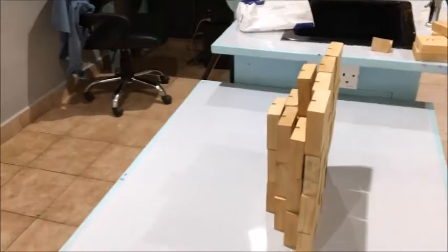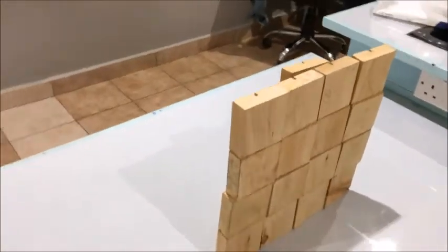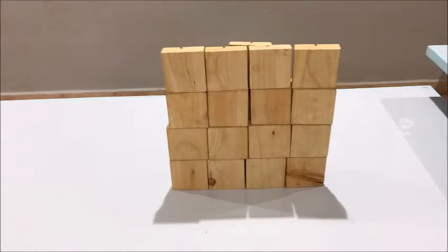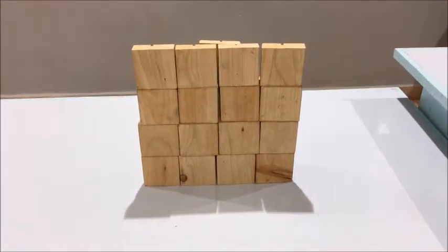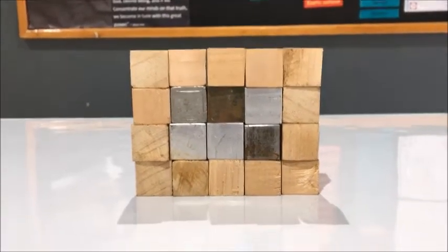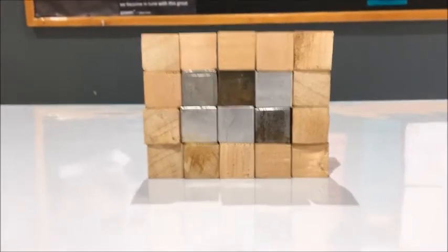And it's not just about shape, it's also about densities and things like that, and absorption, just the way that it always was before. So to model that a little bit more, I'm going to make up another set of voxels now. So I want you to imagine now that we are looking at a thumb end on.